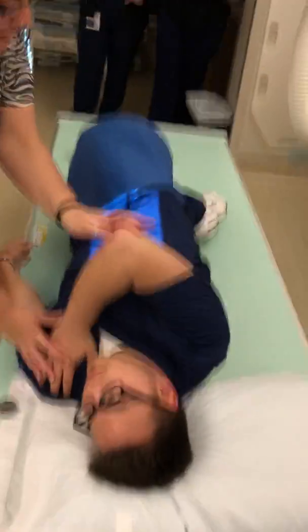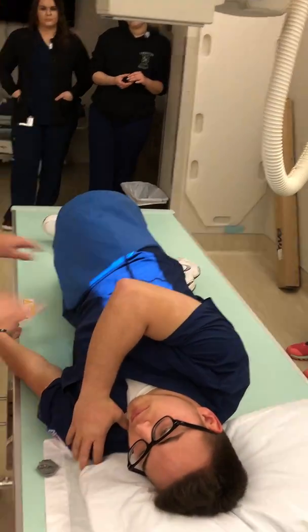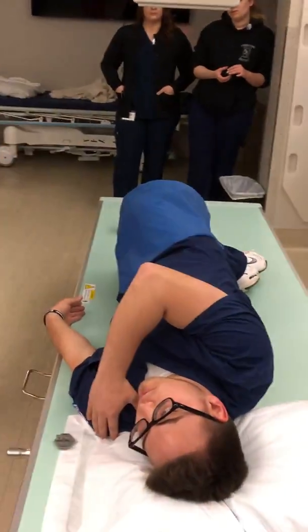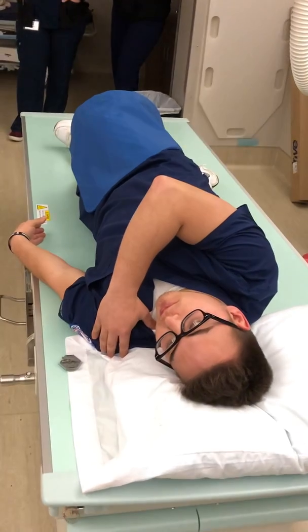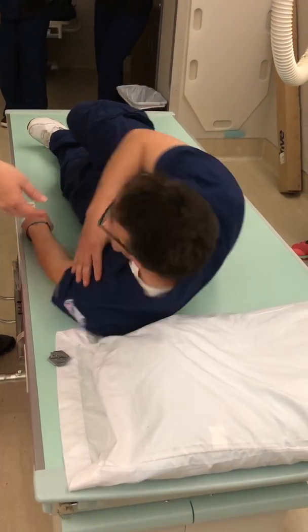Bring the elbow up out of the way. Good. You want to maintain that. Blow all your air out and hold it out. Breathe and relax. Now for this one, roll up on your side completely facing me.